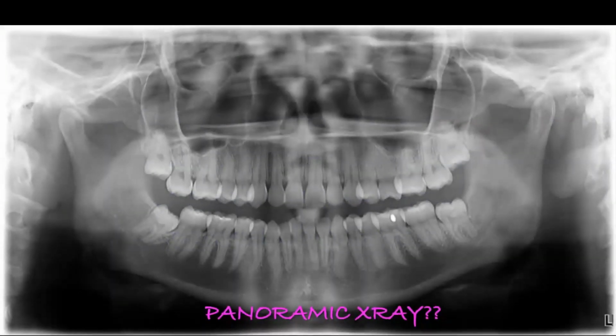So this is a panoramic X-ray. When people are building offices and they say, I'm going to get a digital pan, they want to do it for insurance purposes most times. And in general, pans are really poor diagnostic tools, in my opinion. You can't tell if the root of a tooth is in the nerve, buccal to it, lingual to it. You can't tell if there's any interproximal caries anywhere. There are so many different structures that are superimposed on one another. It really doesn't help you.